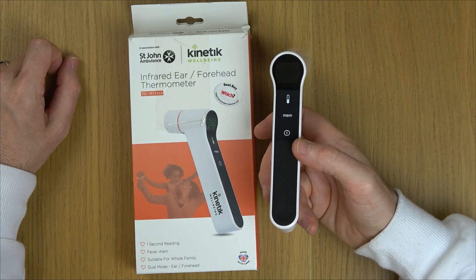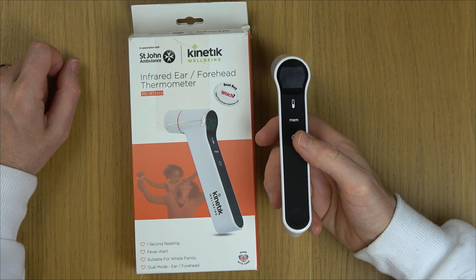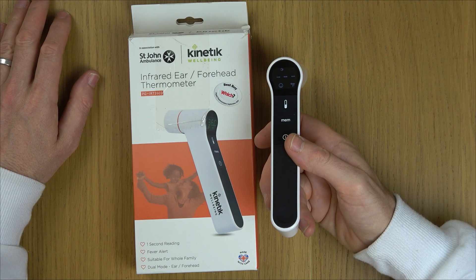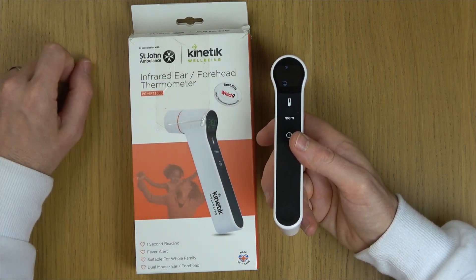So let's leave it on Fahrenheit and then I'm just going to turn it off. Next time we turn it on, it will be in Fahrenheit. So watch this — turn it on now. And can you see, we're now in Fahrenheit.